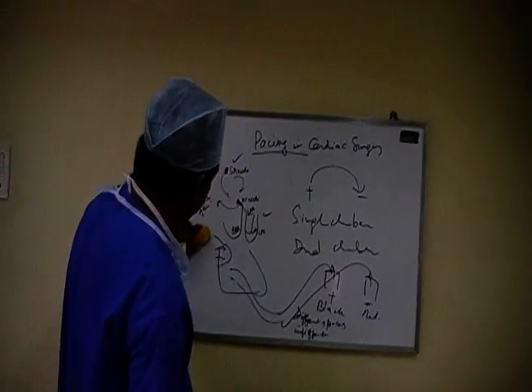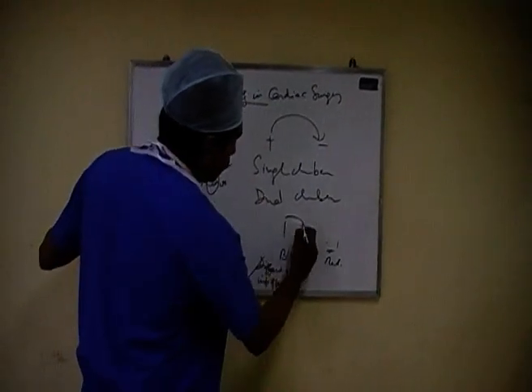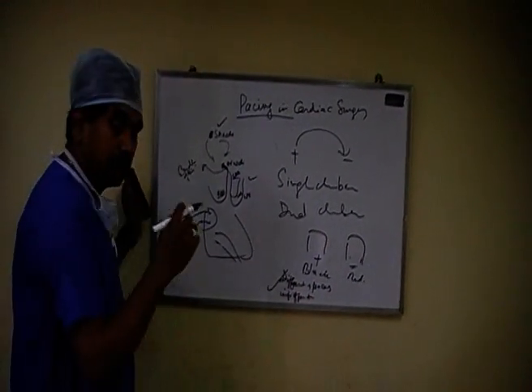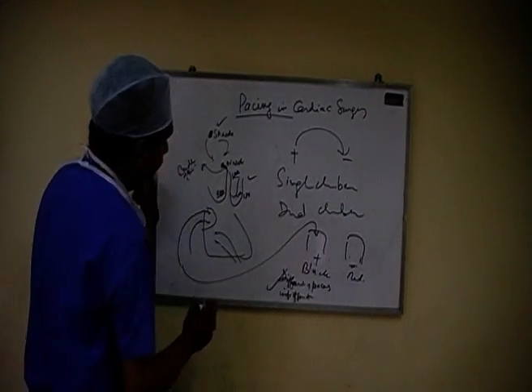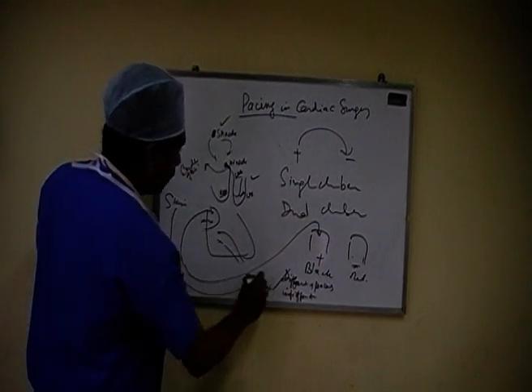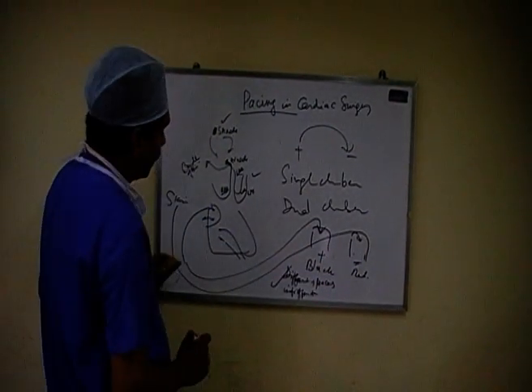So now in AAI, what we need to do is, if this is black and if you got AAI pacing, always the lead that is there on the heart should go to the black. And if there is no other lead, a skin lead can go into the red one. This is good for AAI.